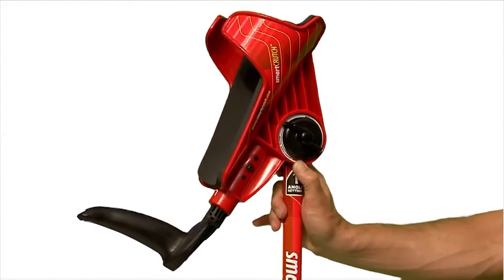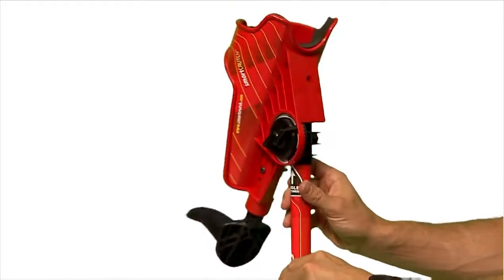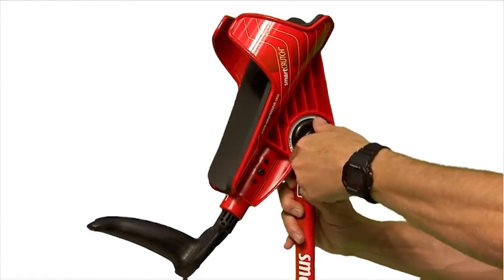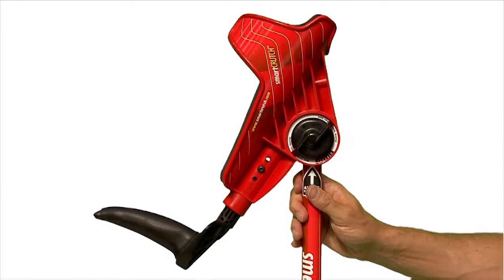Line up position 1 with the arrow and begin tightening the wing nut while ensuring that the teeth are meshed correctly by looking at the back side of the crutch. Once meshed, make sure to adequately tighten the wing nut to avoid loosening.